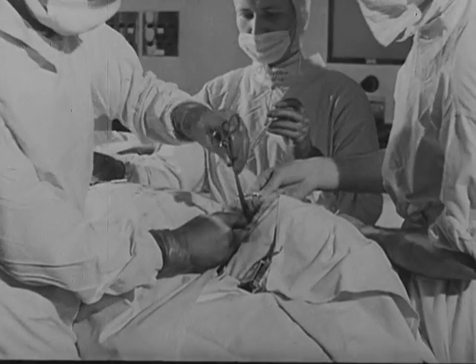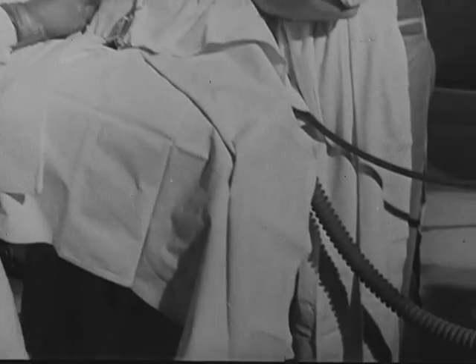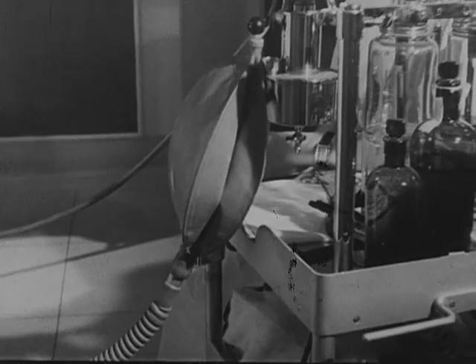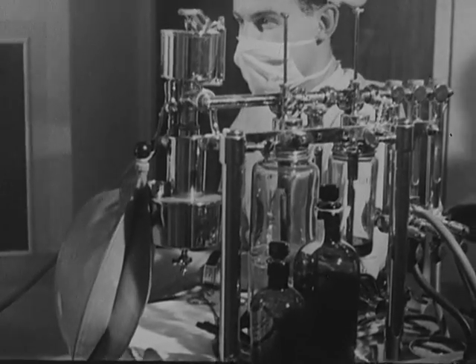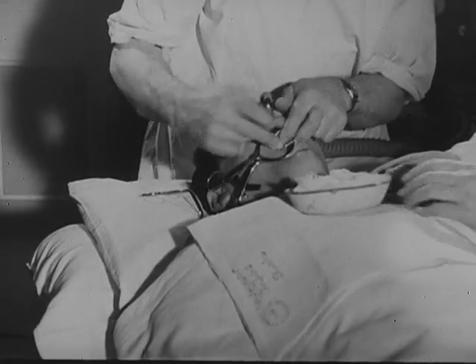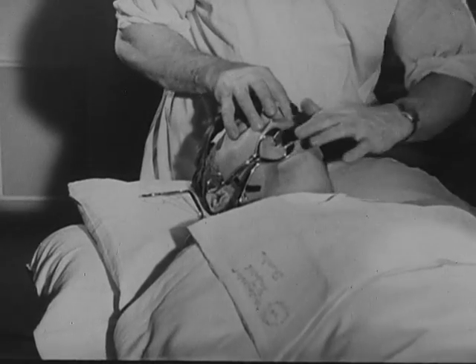Once a free airway is assured, the anesthetist and his apparatus can be completely clear of the field of operation. By watching the movements of the rebreathing bag, he can detect immediately any change in the character of the patient's breathing. By packing the patient's pharynx with gauze, he can be protected from the entry of blood into the trachea.